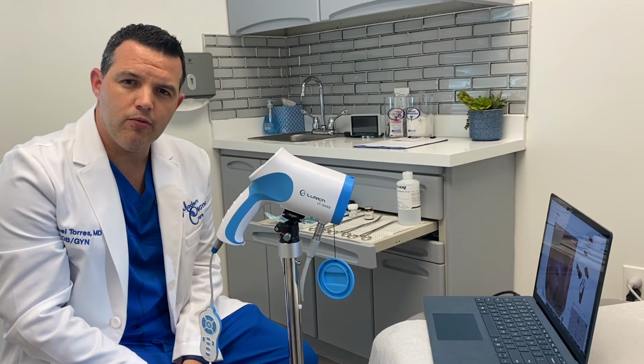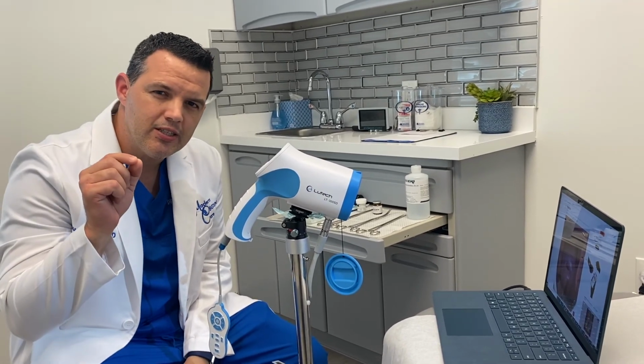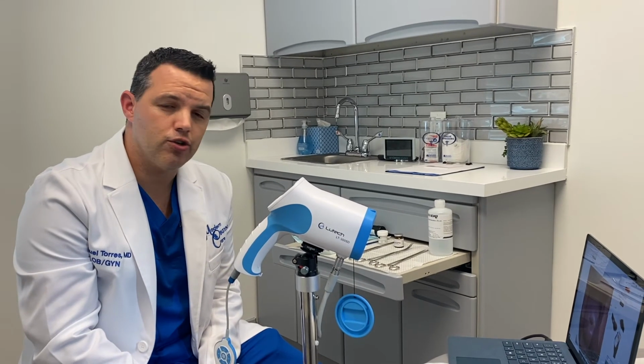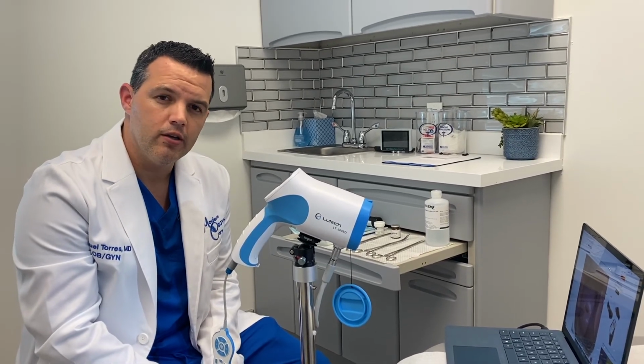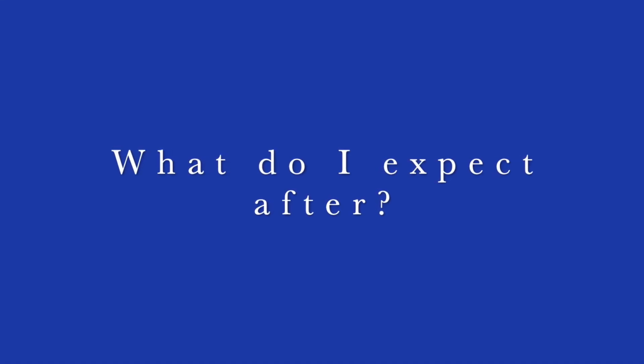It's not very painful. Just think about it like a little pinch of your cervix where we take a tiny little piece of tissue. It's not considered surgery because it is an in-office procedure. It's very quick. Usually it's about 5 minutes in length from beginning to end.